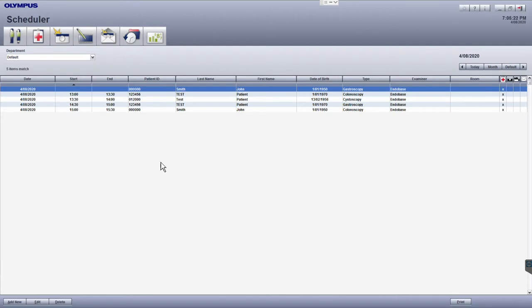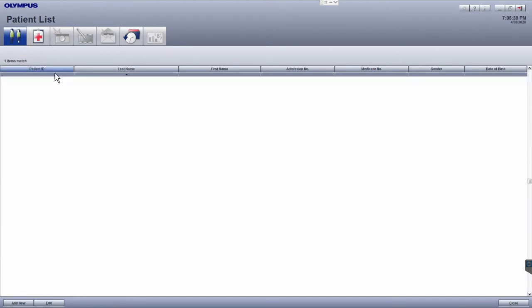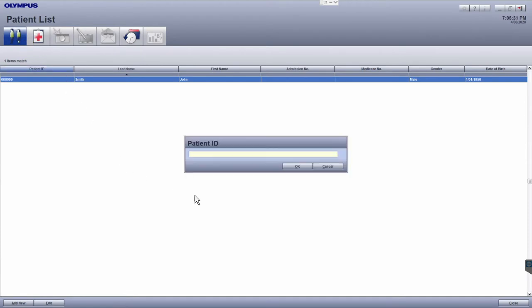To access patient history, first click on the patient list module in the top left. Then click on the patient ID column and enter the patient ID details.